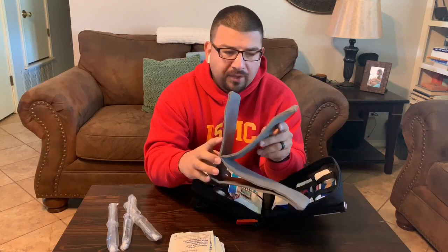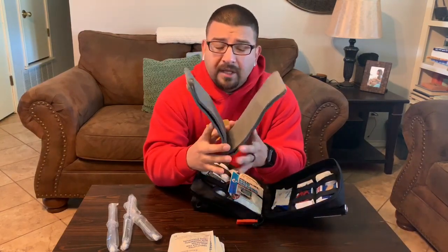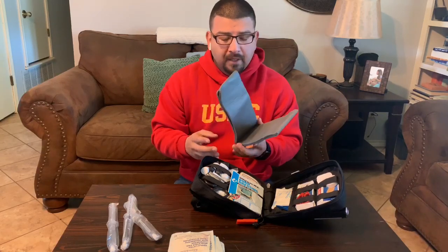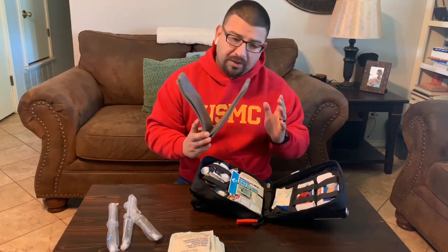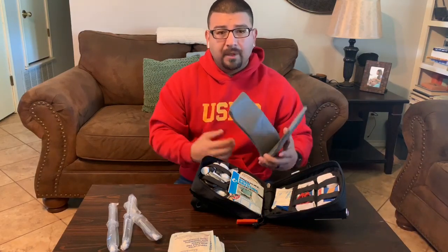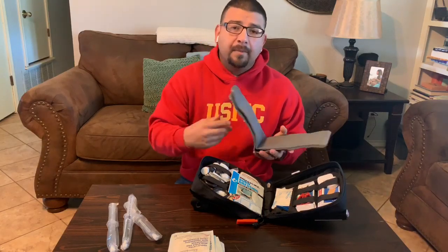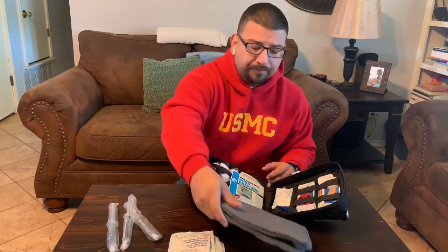The next thing I have is this thing, and I'm not 100% sure what it's called, but it's got a wiry, foldable feel to it. This will work if you have somebody with a head or neck injury, maybe even a back injury. You can wrap this around their neck, form it to their neck without it squeezing on them, and keep their head and neck positioned so it's not bouncing around when you move them. Another thing you can do with this, if somebody breaks their arm or leg, you can open this up, put it up against that extremity, and then tape it up to keep it as straight as possible so it's not causing them any more pain when you're moving them around.